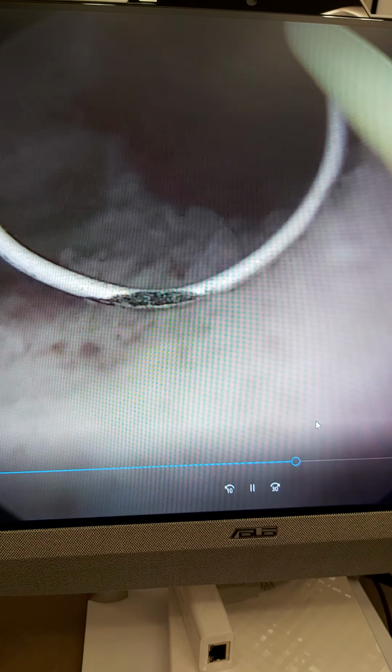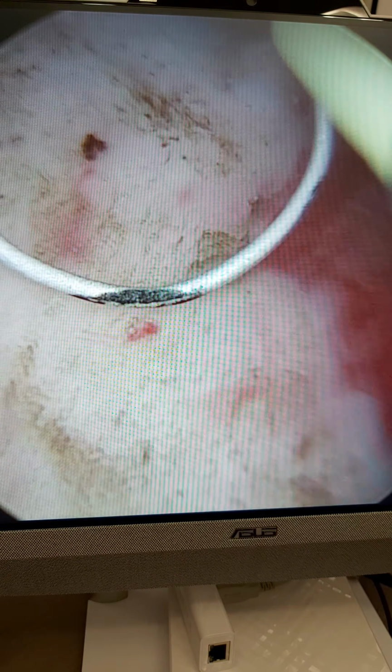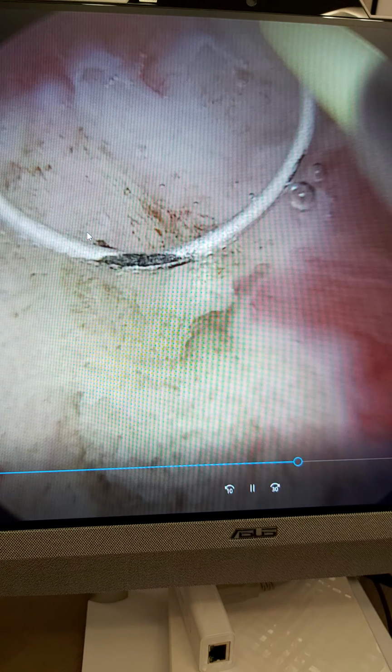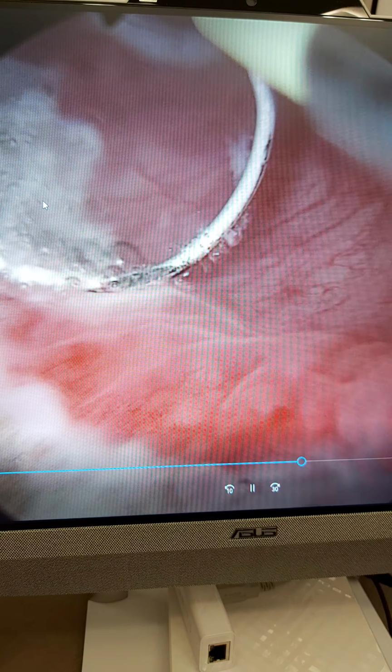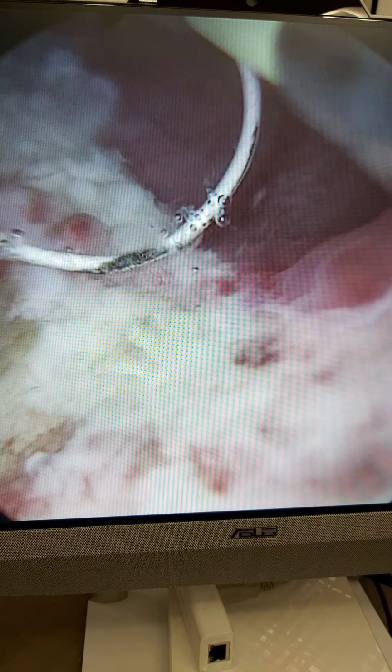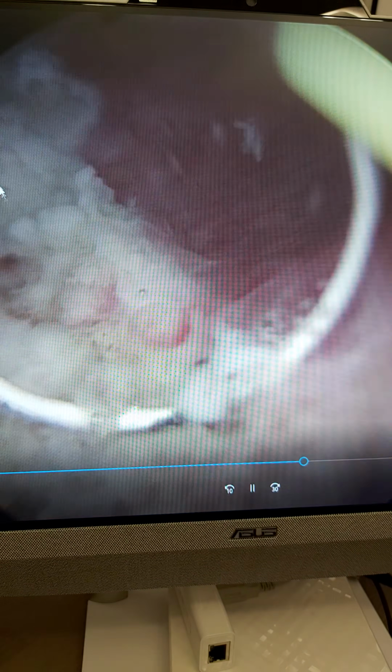So we clean the bladder. Here the resected parts healed very nicely, but the tissue damage is deeper. We try to fulgurate other parts, but as you see, when we fulgurate, the cystic infective tissues become prominent and they don't completely disappear.